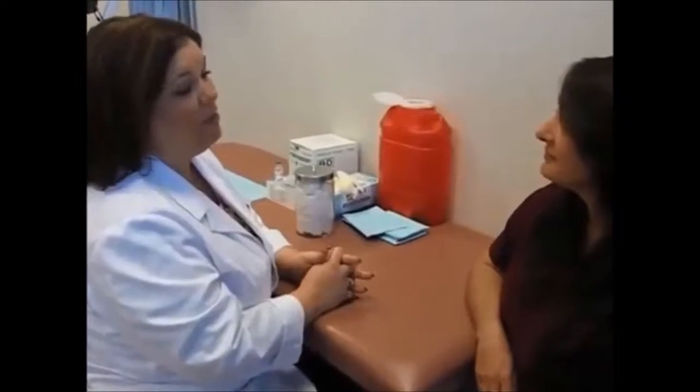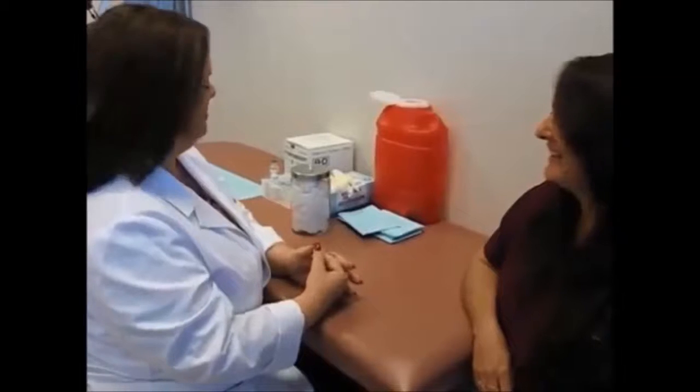Okay. Good afternoon, Rosie. My name is Shannon. I'm here to give you a PPD test today. May I verify your last name and date of birth? Traversy, 11/30/68. Thank you, Rosie.